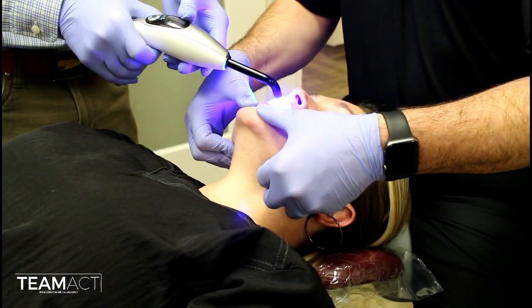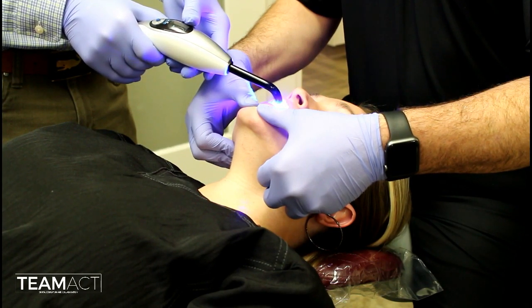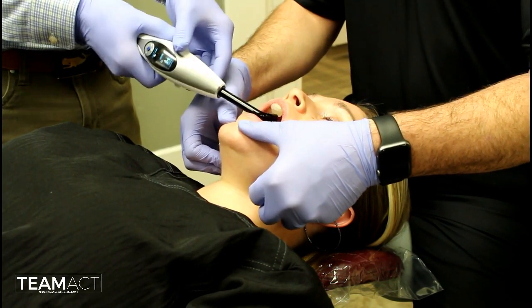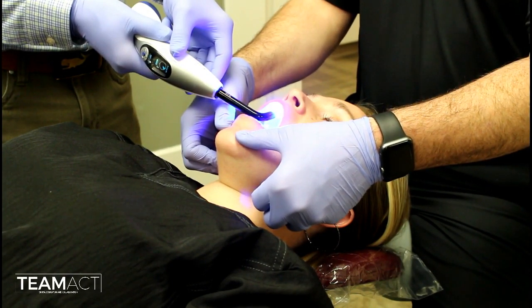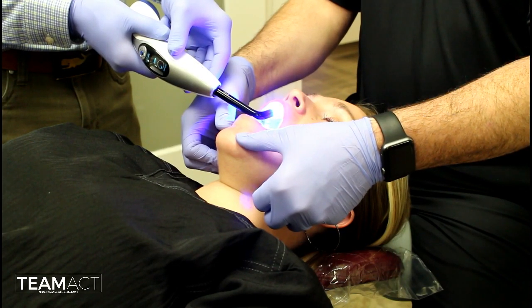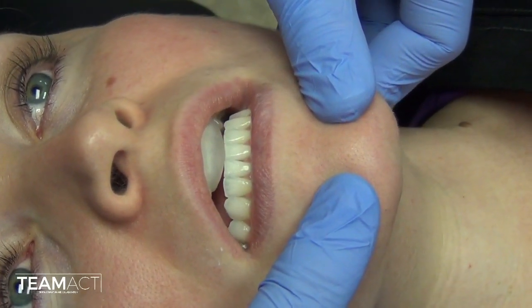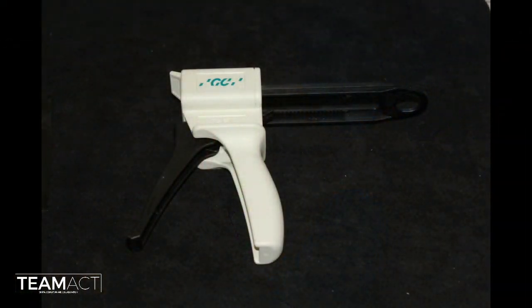I will have my assistant cure that triad piece until it is set. Once it is set, I will guide the patient through that series of movements again to ensure it is in the proper position. As you can see, the patient closes right into that jig that we have just made.